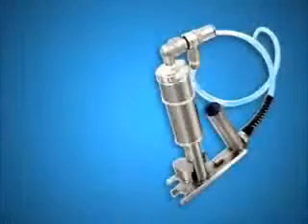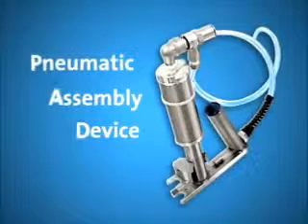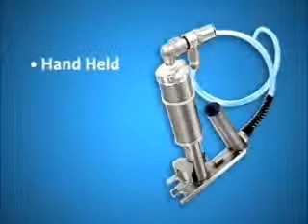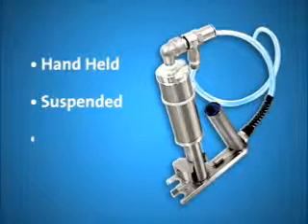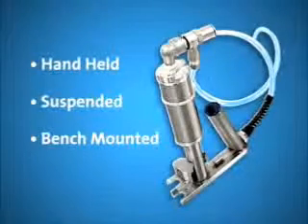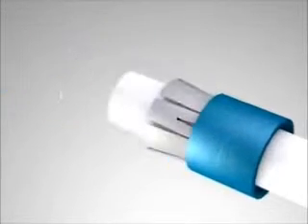The next method of assembly we will demonstrate is the use of the Barblock pneumatic assembly device, also called PAD. This tool can be handheld, suspended from a tool balance reel, or bench-mounted and actuated with a foot pedal. The method demonstrated in this video is handheld. Pre-lock the sleeve and collet and place on top of the tube.